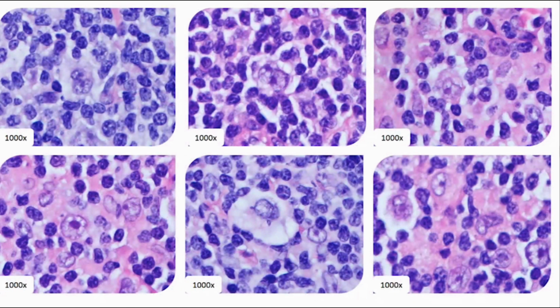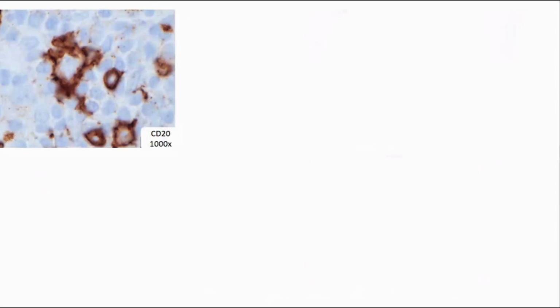Multiple cells were seen throughout this case that were atypical and large. So here you can see some background scattered small lymphocytes and histiocytes, but you have these multi-lobated cells with prominent, multiple nucleoli, the characteristic LP cells, or so-called popcorn cells. You probably know where this is leading.